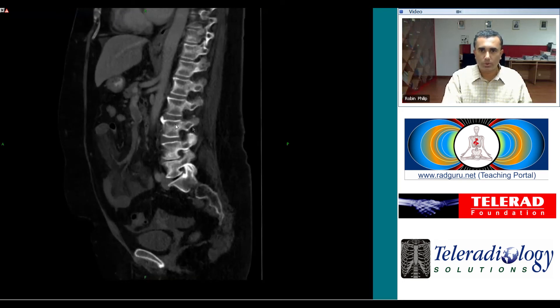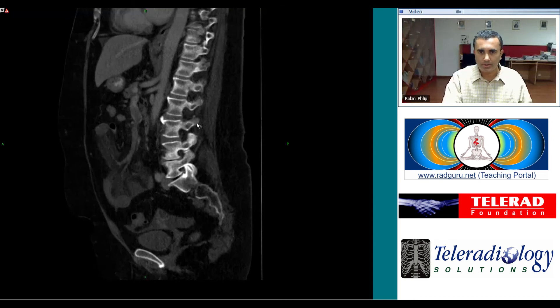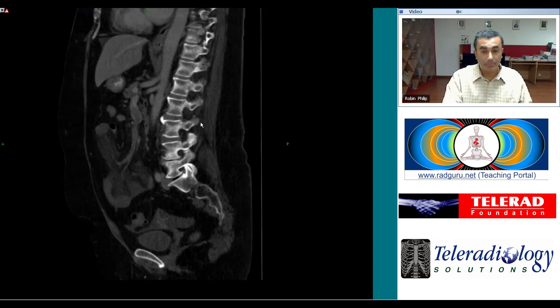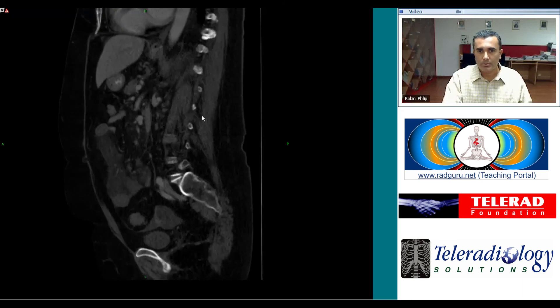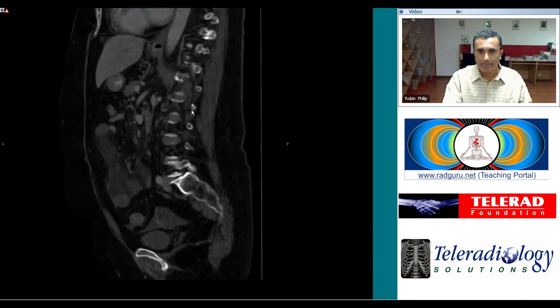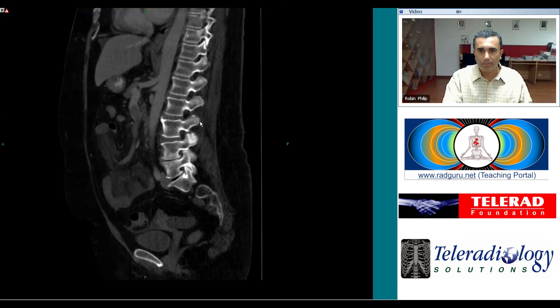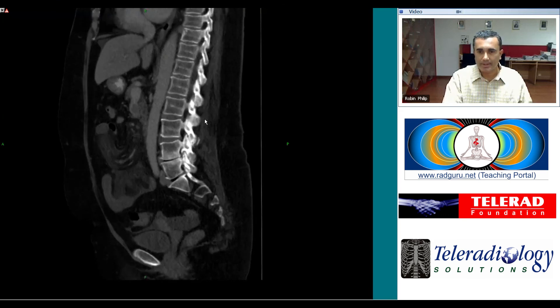One of the learning points in this case is that for tubular structures that run in the plane of the long axis of the body, the reformats are particularly helpful, because when you see things in cross-section while scrolling through, you may miss them. So always remember to look at reformats when looking at CT of the abdomen. Thank you.